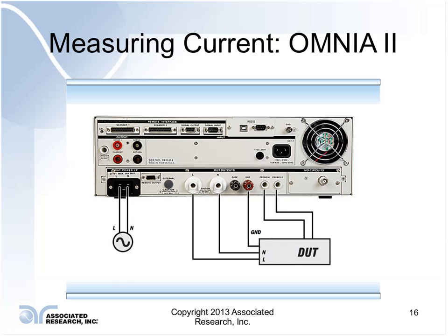So what we have here is we have power supply exhibited here, and we're bringing power into what we call our DUT input. This goes through the unit through a series of relays, and these are the relays that would simulate your fault conditions, and then that power is output on line, neutral, and ground to our DUT. So that's how we're able to boot up the DUT. We have internal relays which simulate these fault conditions, and then the measuring device is also in the unit so that we can get these measurements.